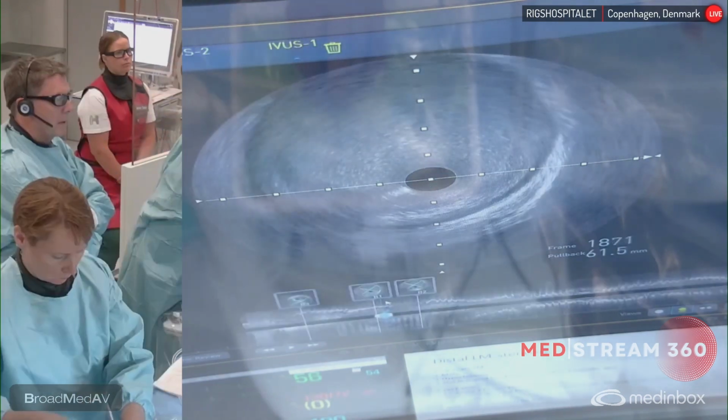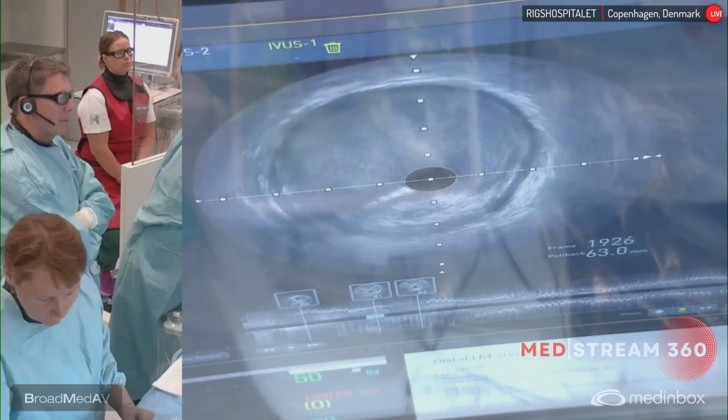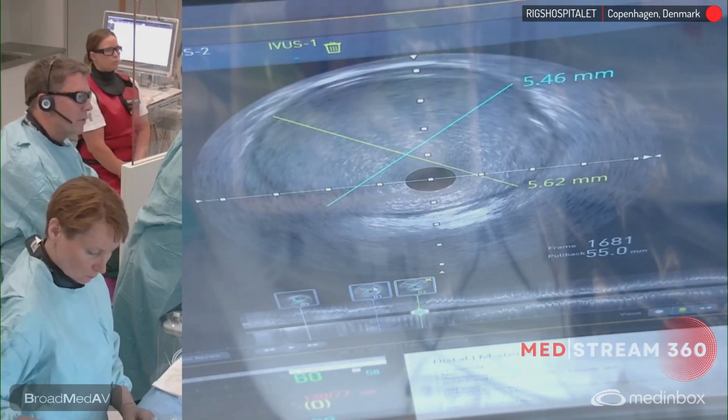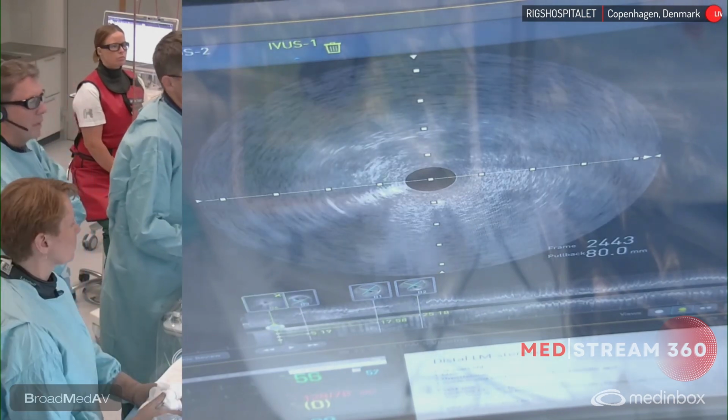But when we go ahead and stent, we need to make sure that we cover the dilated segment of the LAD and that we cover all the way to the ostium. This actually looks like a fine landing zone, this one, don't you think? And then all the way to the ostium here. So that's a 25 millimeter.